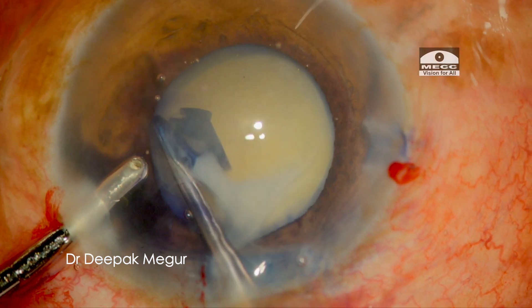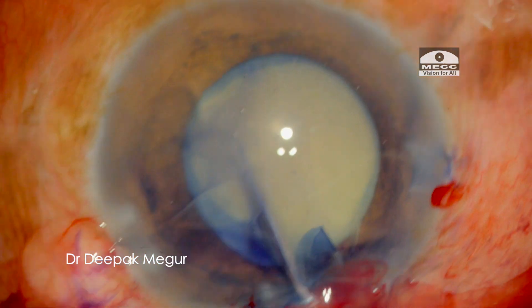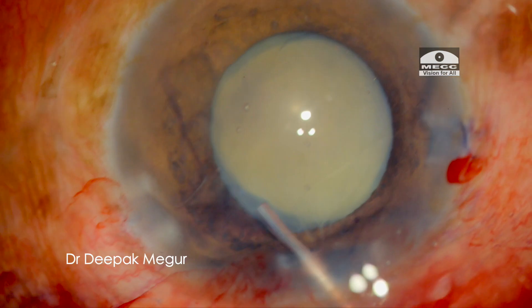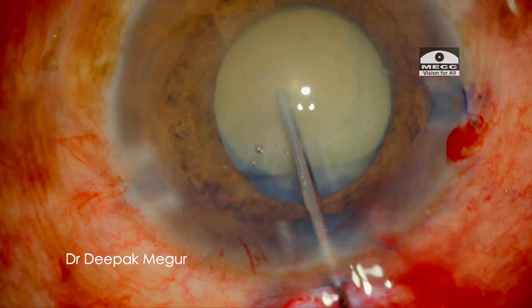The real challenge will be during the nucleus management, since the nucleus will be free-floating and will not have any epinuclear cushion, and the capsular bag and the zonules in this elderly patient will be weak.